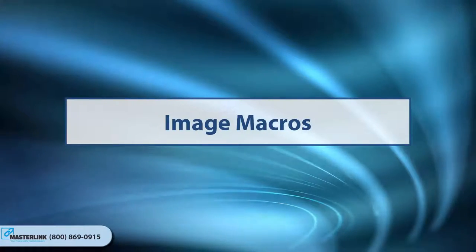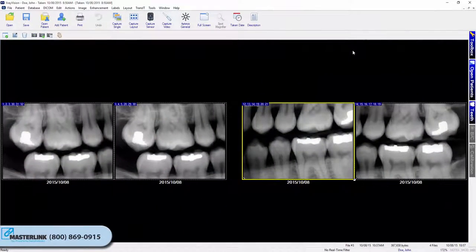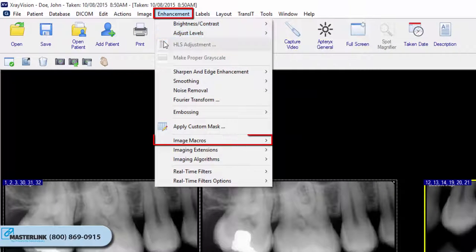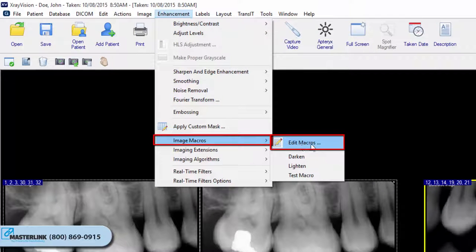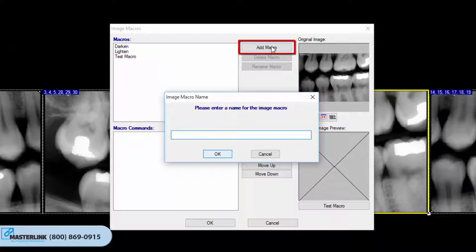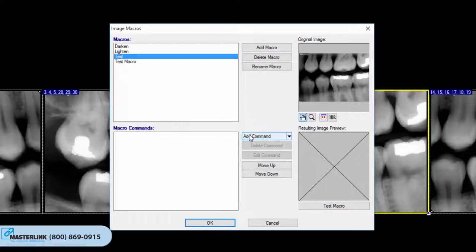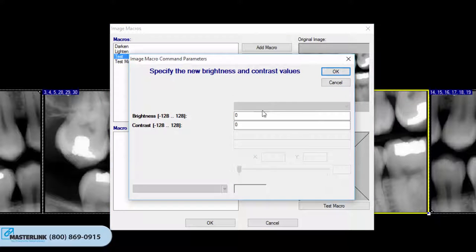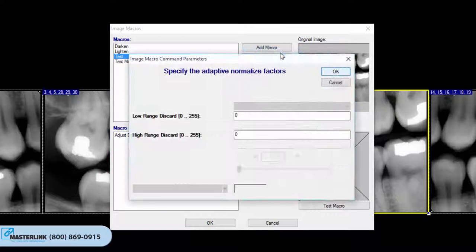Image Macros. Image Macros allow users to create a customized sequence of enhancement filters that can be applied to images. To create a customized image macro, open a patient image and from the menu select Enhancements, Image Macros, Edit Macros. Click Add Macro and enter a name. Click on the macro name to select it, then click Add Command to add and customize a desired filter. Repeat this process to add a sequence of filters. The macro will trigger the filters in the order displayed under Macro Commands.